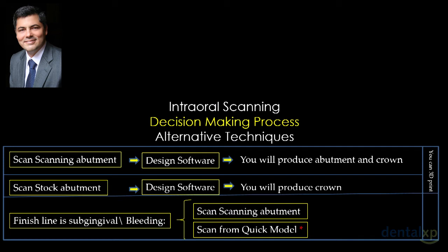So this is what we're working on now, because doctors are buying the devices, but sometimes we get confused on the protocol. There are no written protocols. There are no set decision-making processes. So this is my contribution for you today, because this is the way that we have been doing it in our practice. Hopefully, some of you might be able to get some of this into what you are doing.